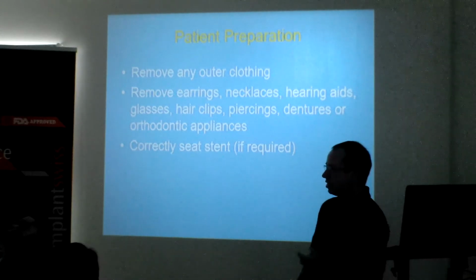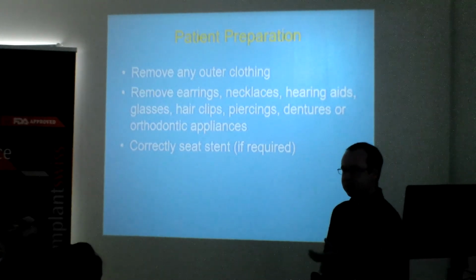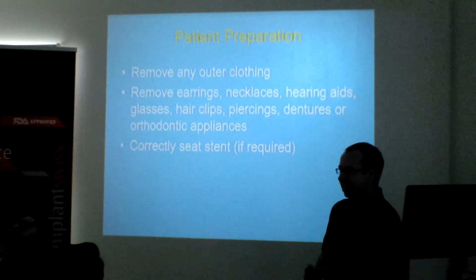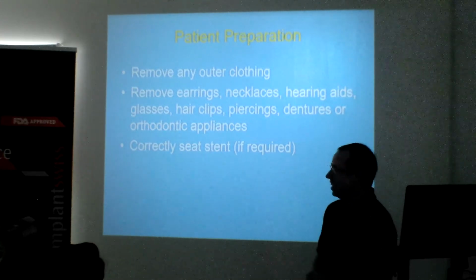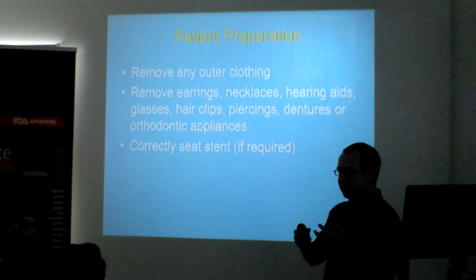And things like if you want us to put something over the denture, make sure it can easily come off. We've had solutions given to us before now. We've had to send the patient back to the dental surgery because we can't actually remove it. And ball bearings and wax, it's not a good idea to give a radiographer these things because we don't have the foggiest what we're doing with them. Yeah. We have no idea. So it's always best to do something that can be put in that has been tested beforehand.